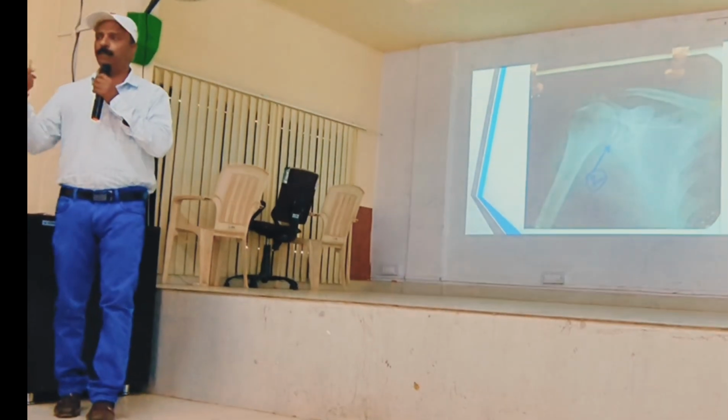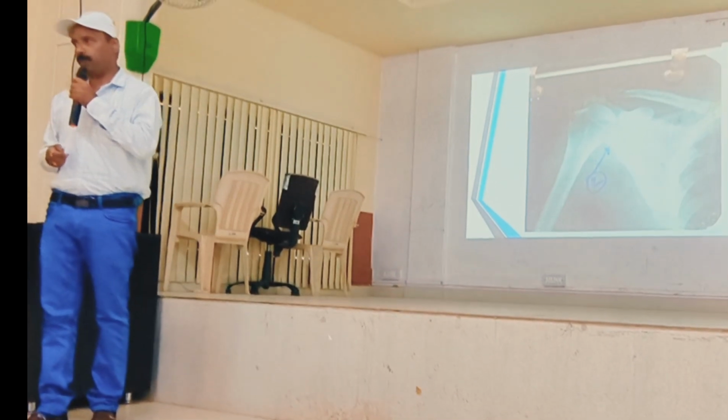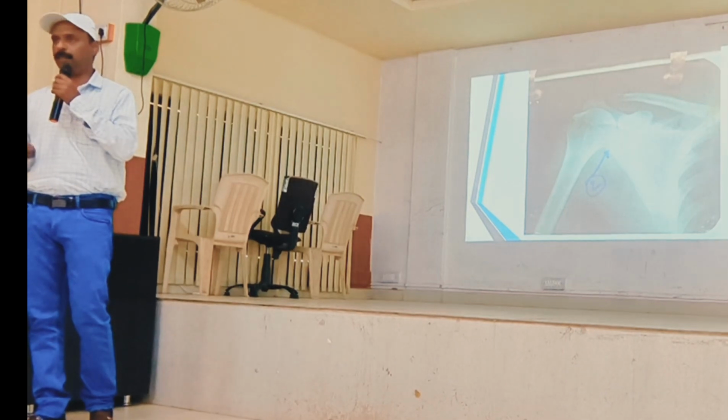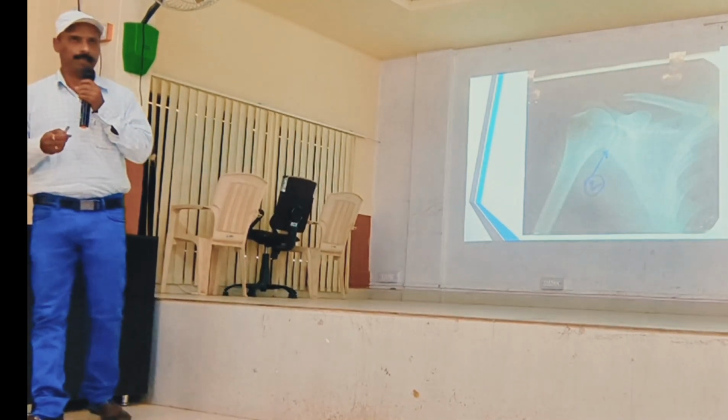We are going to look at a few important simple X-rays, which you will commonly get in your practice and in your exams.